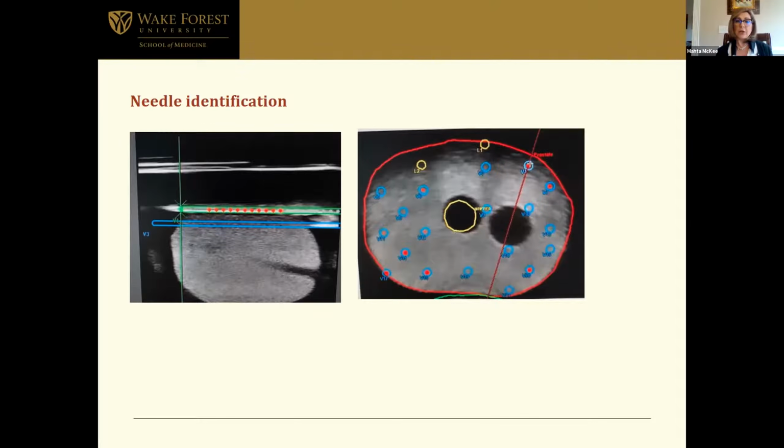As you will see further on in the presentation, there are multiple methods of optimization. Depending on what kind of optimization you're using, catheter insertion can be different, or catheter identification can be different. If you're using Hippo, and I'll get to that in a minute, you can have pre-selected needle locations that would actually come up on your screen once you run the program.